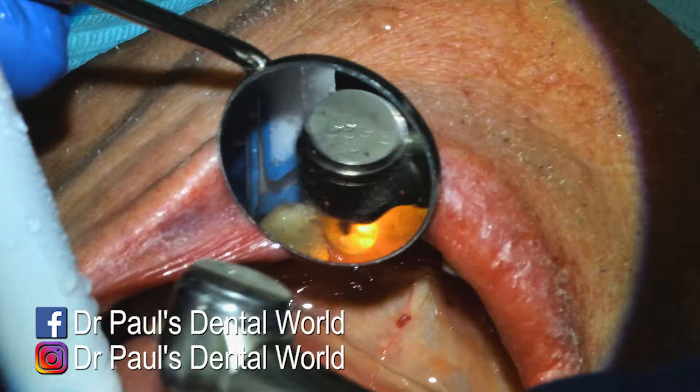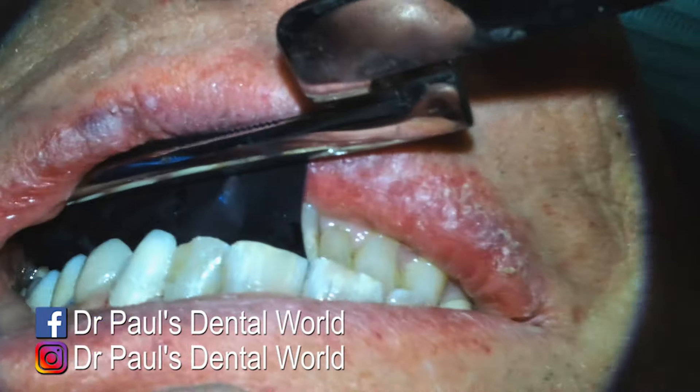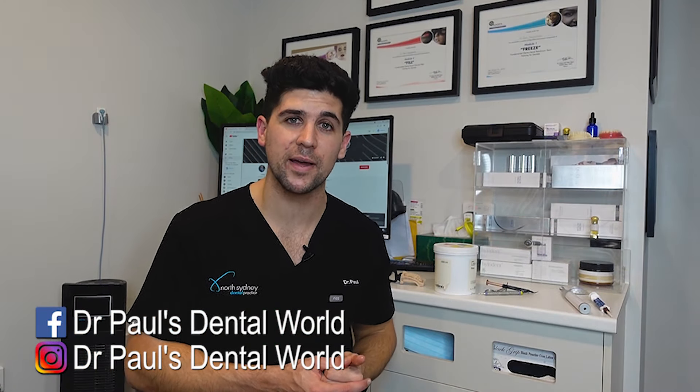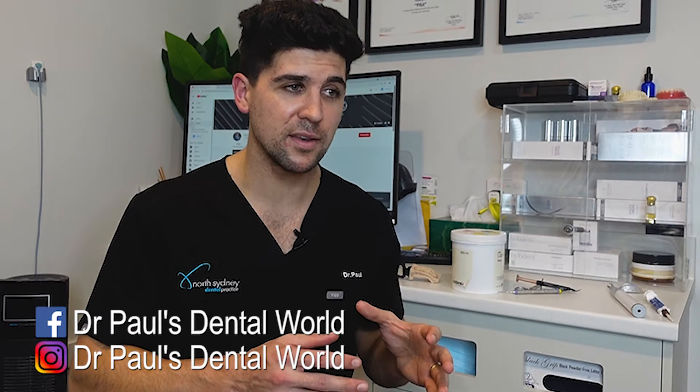Any flossing that I need to between the teeth too. Check the bite again and then we are good and we're done. So I hope you can get something out of that video. There's a few little tips that you'll be able to pick up to make your temporary crowns fit a lot better. You'll find fewer adjustments needed, fewer of them falling off, and just overall you'll have a better time — and so will your patients.